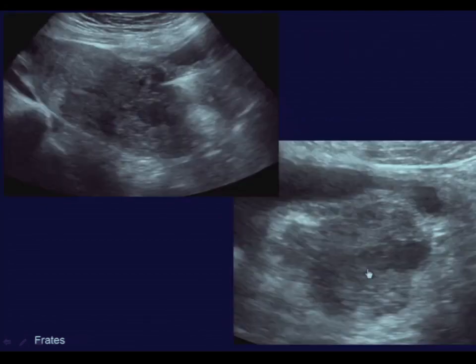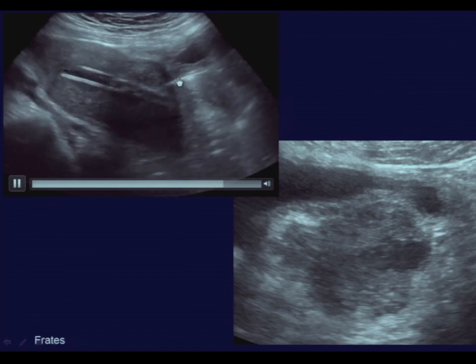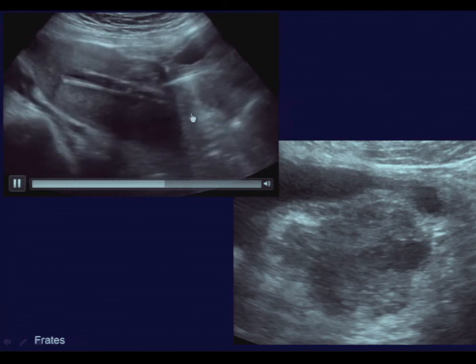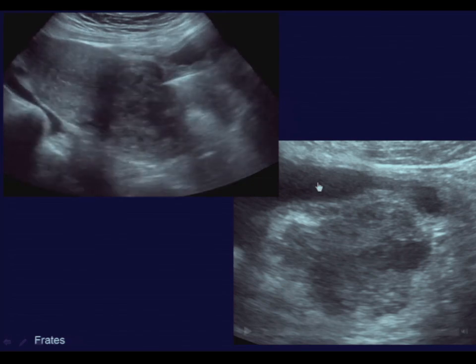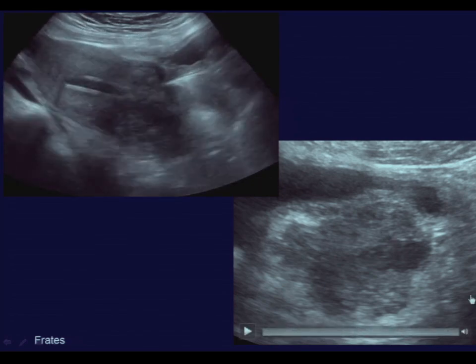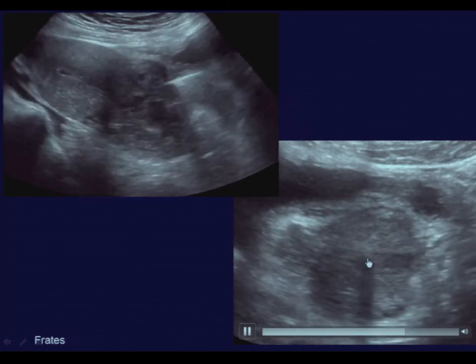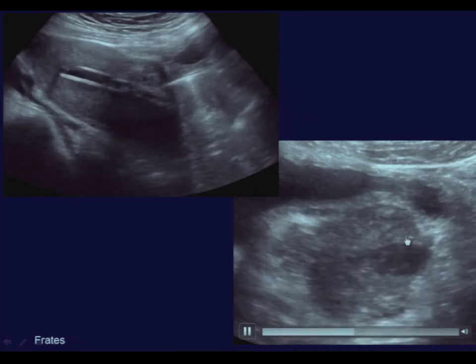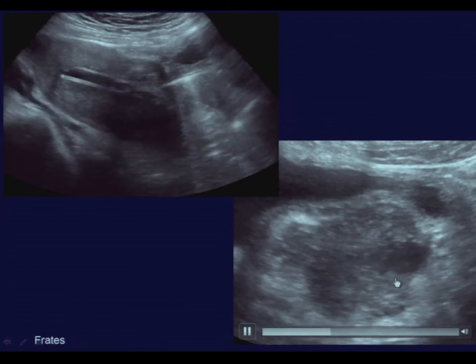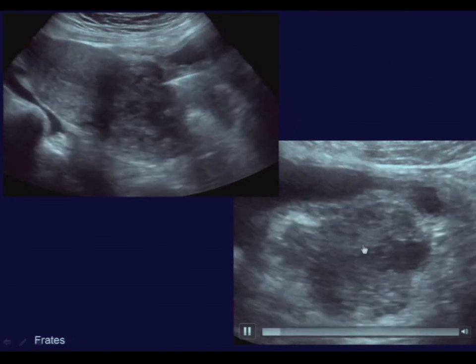So an attempt was made to now evacuate under ultrasound guidance that large hematoma. And we can see the catheter sitting up at the top of the fundus, right smack through the middle of all of this material, and the majority of this material was removed successfully at the time of the procedure. But we did note that on this transverse image that after the catheter, suction was applied, everything removed, and then a complex fluid collection would build up again, and then with suction collapse and then build up again. And this is clot or free bleeding that was still happening after the procedure.